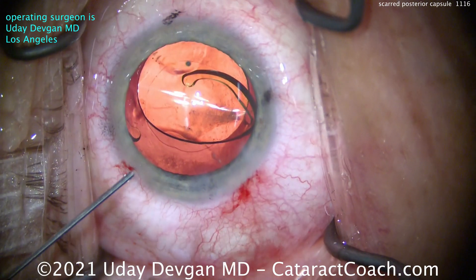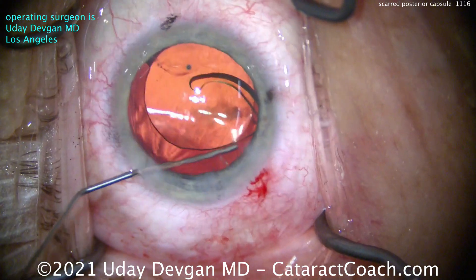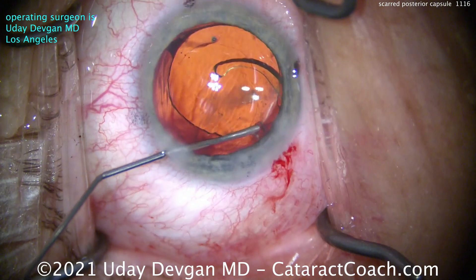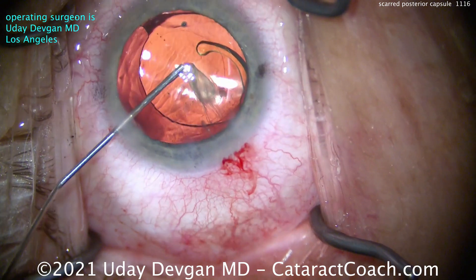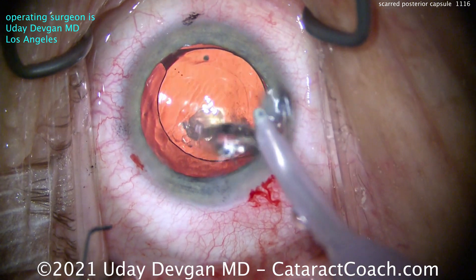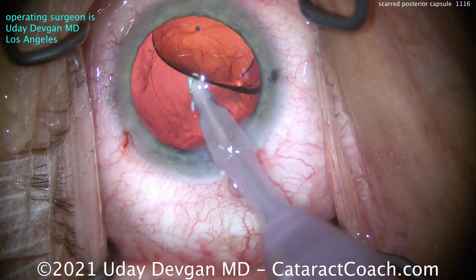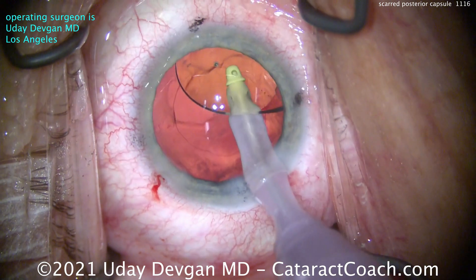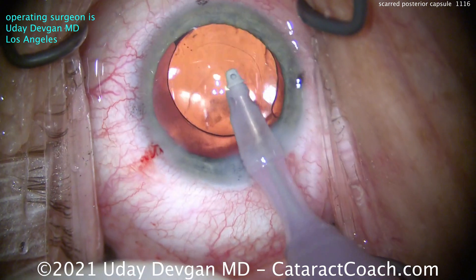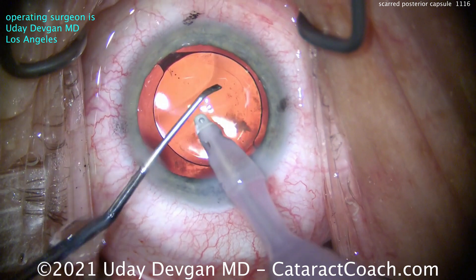You can see the toric markings on the IOL and the marks on the cornea, which we'll use to line up the lens. The phaco incision is exactly on the steep axis, which is about 30 degrees or so. I'm using BSS on a cannula to go underneath and pull out any remaining strands of cortex — really want to clean this up nicely. Found a little more — there we go — just aspirate that out using the I/A probe. We don't want to leave that in the capsular bag as it will cause post-op inflammation. Now we remove viscoelastic, going behind the optic with the toric lens so the posterior capsule is in direct contact with the posterior aspect of the optic. This toric lens will not mal-rotate.